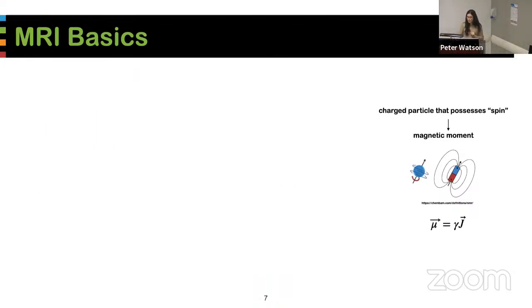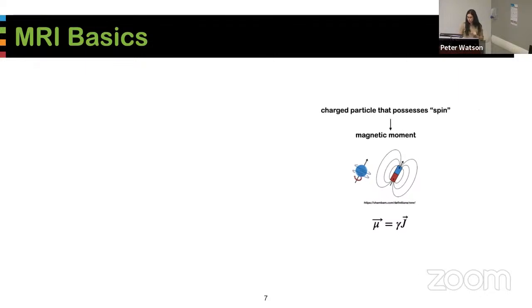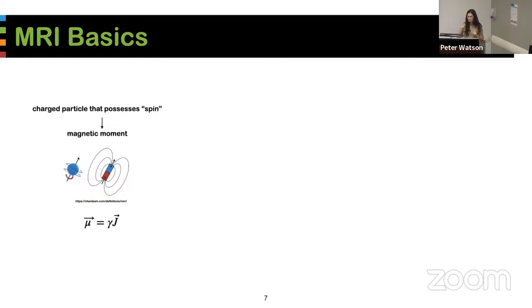Next question is, what happens when you put these particles inside a magnetic field, like that of the scanner?